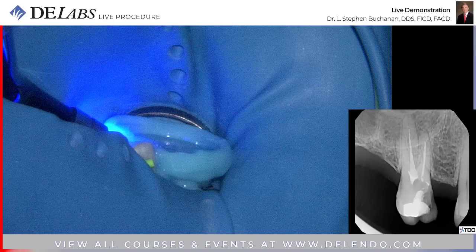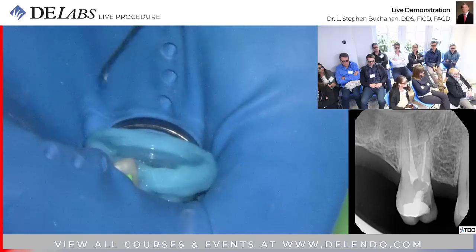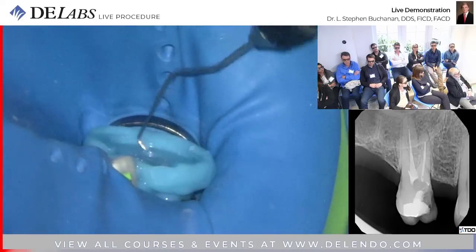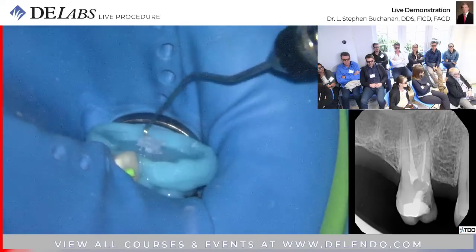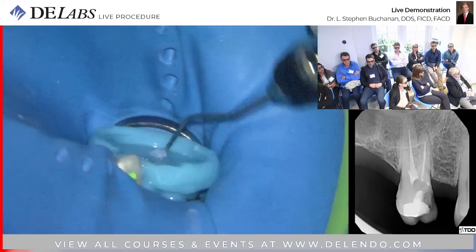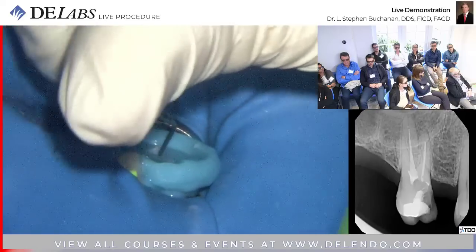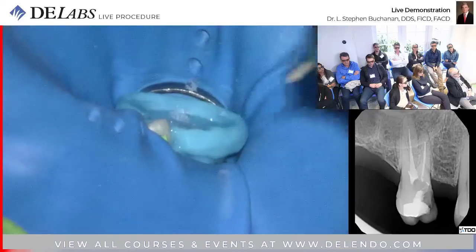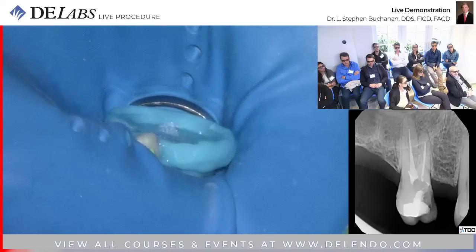Okay, let's take that out. The alternative is just put the drill in there and grind it out. You can get that out, that'd be great. You turn water spray on.